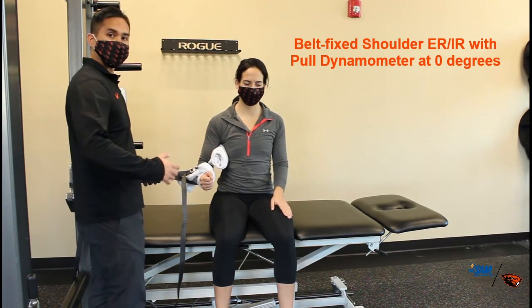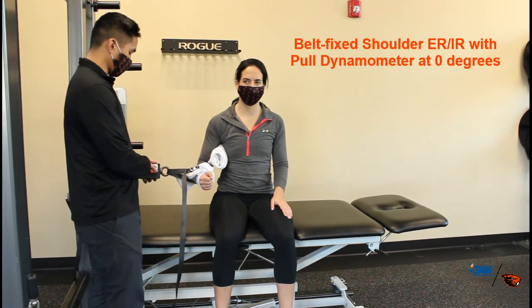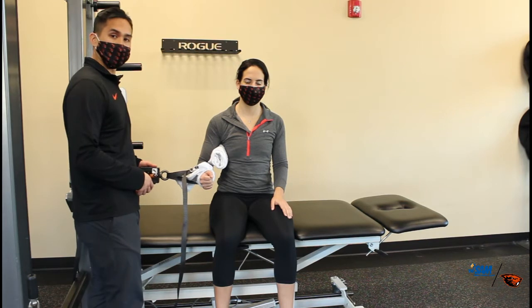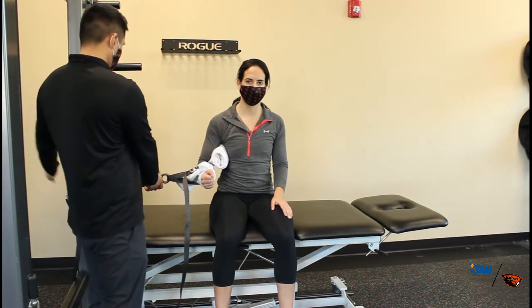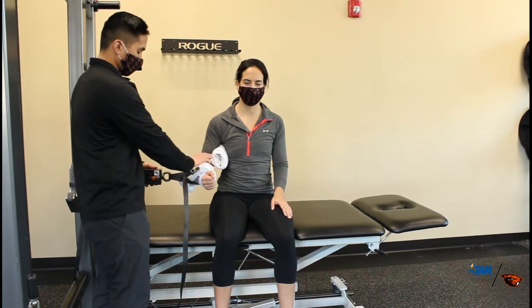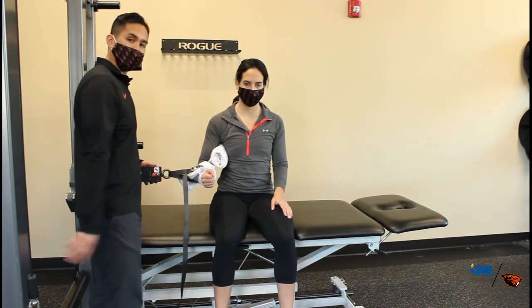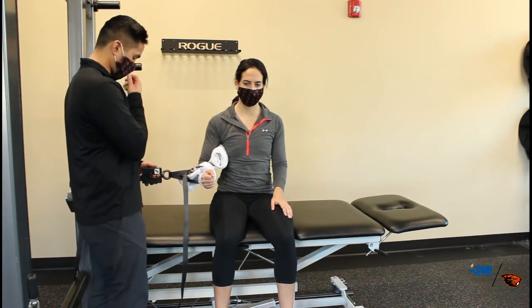We're going to measure ER and IR to assess shoulder rotation position using the pulley method. This is a Peak Force handheld dynamometer. We attached one anchor point to the squat rack and another strap to her wrist, proximal to the styloid process. We do have a towel for patient comfort.